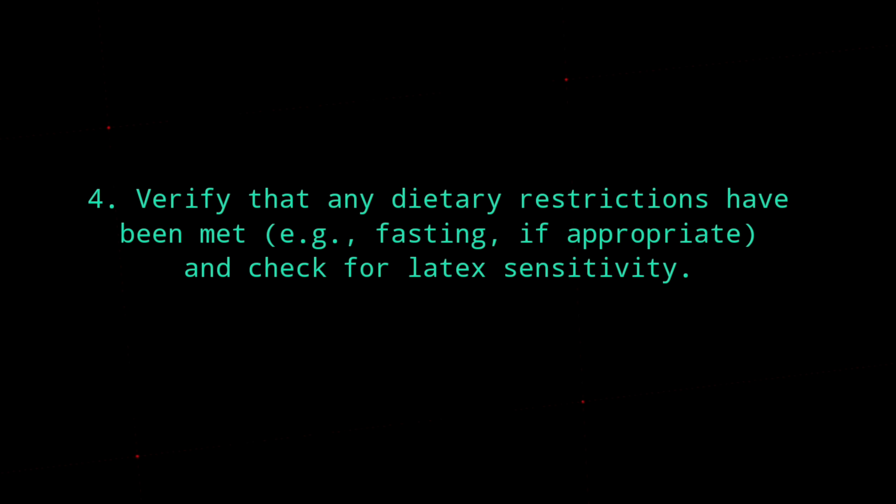Example is fasting if appropriate. And check for latex sensitivity. So ito yung mahalaga, kung mayroon tayong mga test na nagre-require ng fasting, we should ask them if fasting sila, and we should also ask the hours kung ilang oras sila fasting. Kasi pwedeng ilang oras lang, 4, underfast sila, or overpass naman if like 14 hours, 15 hours.